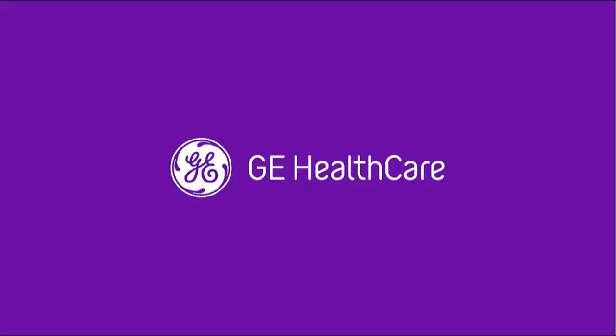I'm not quite sure what you were trying to get with that question. I feel like Flex tends to work really well, and in terms of a compromise between scan time and image quality, it is quite good. Especially when compared with normal chemical sats, Flex very rarely fails unless it fully swaps. But in that case, you'll still have your reconstruction in another series.